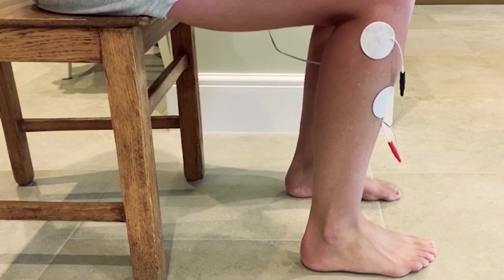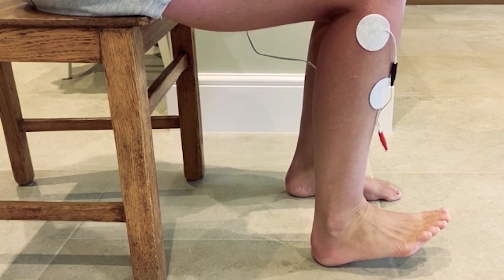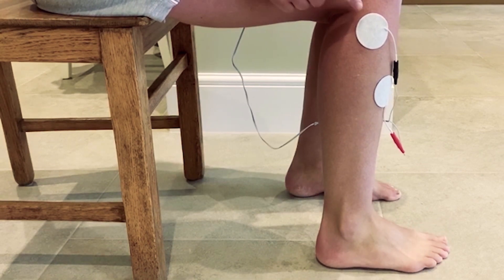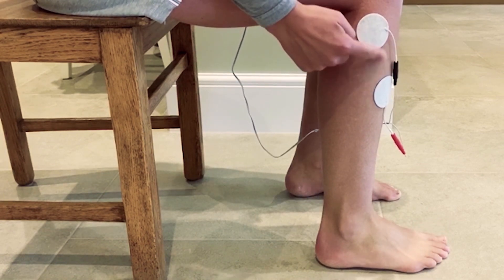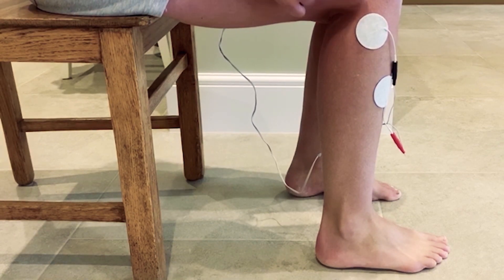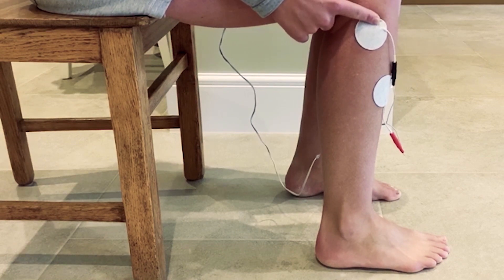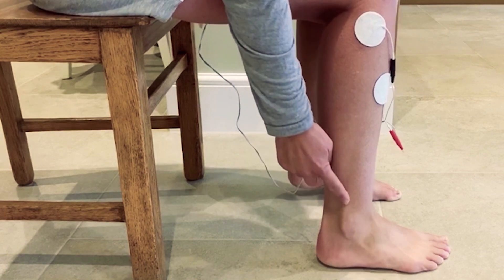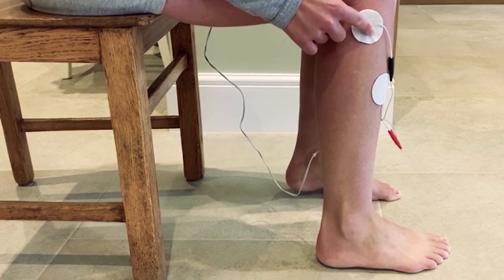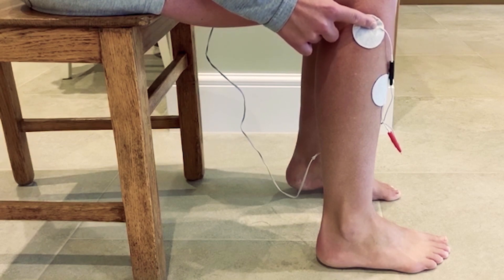In this video I'm going through electrode placement for foot drop — so for ankle dorsiflexion with a little bit of eversion. With our SableStim Pro, it doesn't matter which way round the electrodes are, and I have it on program six. The top electrode needs to be just off the tip of the fibular head. To find this, run your finger up from the ankle bone until you feel the fibular head and place just the top right corner of the electrode on there.